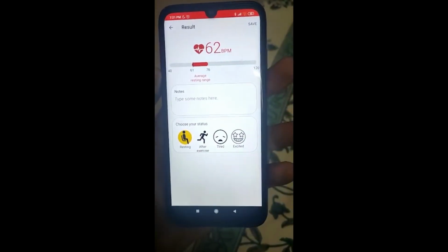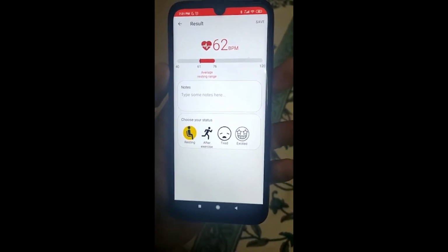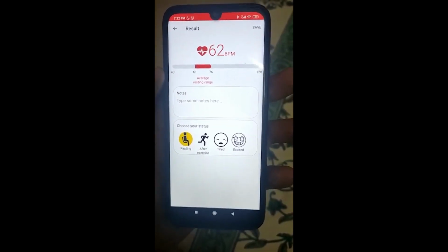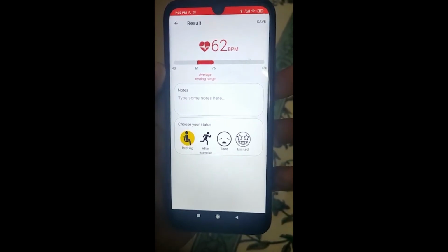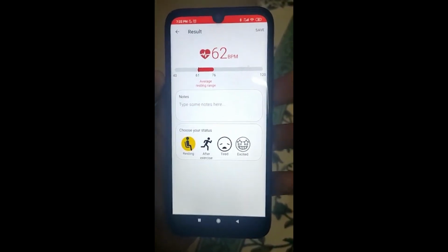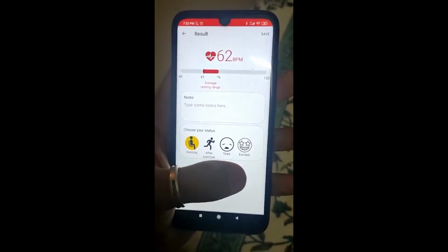So now this is the result layout which we have created in Android Studio. It consists of the save button at the top. Here we can see that 62 beats per minute is our result which we got from detecting by keeping the finger on the camera section. So this is the average range which we can see here, that is 61 to 76, that is the resting range. We can choose our status accordingly.